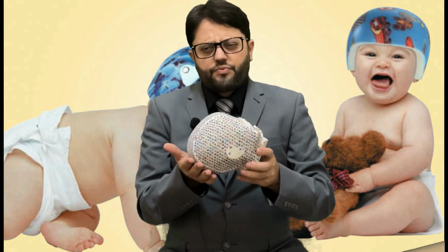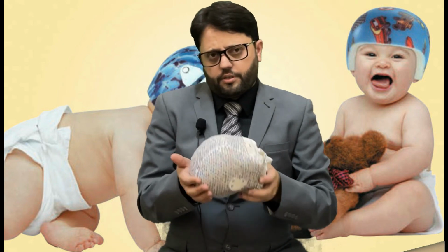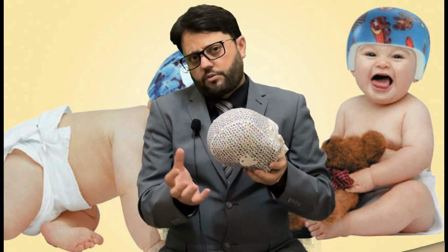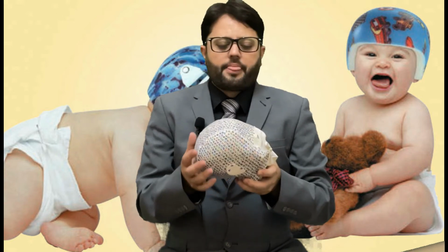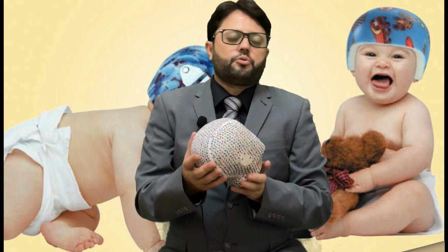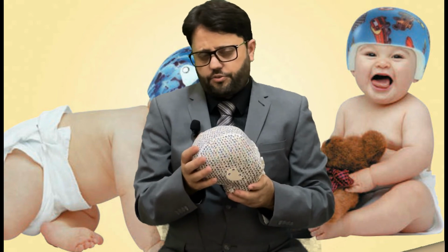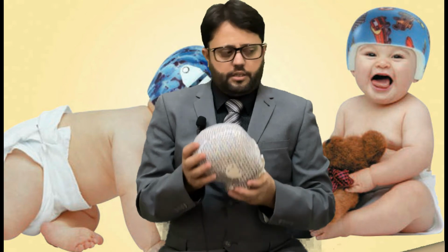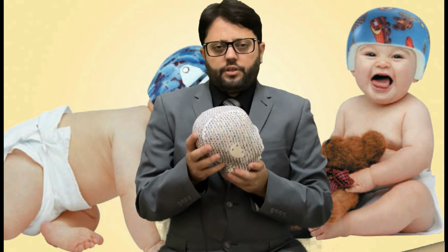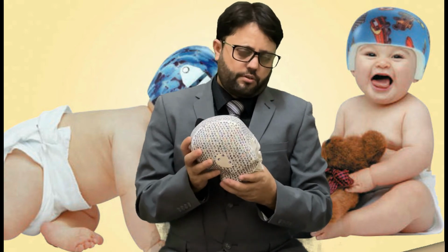There are some pillows which will help a little bit, but we have to reposition the whole body so that we remove the weight from that area and it goes on the area which is coming out, the bossing area. This is the first thing. We will see some kind of improvement in those cases. If even after 4 months there is no improvement, and we see that the severity is moderate or severe, then we need to decide with the parents whether we should go for a cranial remolding orthosis or not.